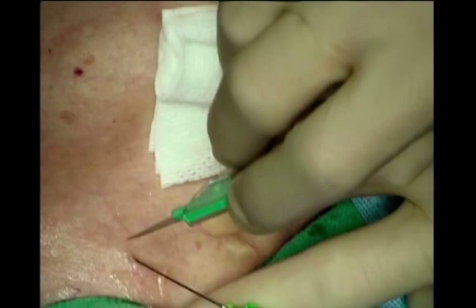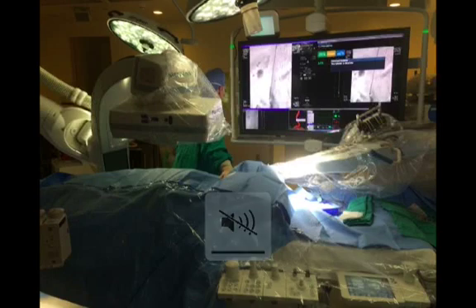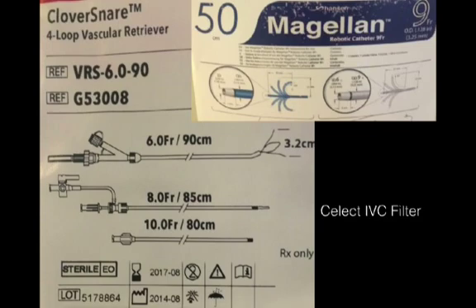Now on to the patient. We use the standard jugular approach — we always use ultrasound guidance to the jugular vein, as you can see here. The setup in the operating room is somewhat different in that the patient is placed on the fluoro table feet towards the robot, with the robot mounted on the bottom left side of the table. This is done with the patient awake under conscious sedation. We reverse the image so that it feels like the patient is in the usual position. Here we can see the robot being assembled and we're about to insert the robotic catheter into the RCM, or robot control module. We were retrieving a Celect inferior vena cava filter using a clover snare and the 50 centimeter long Magellan robotic catheter.